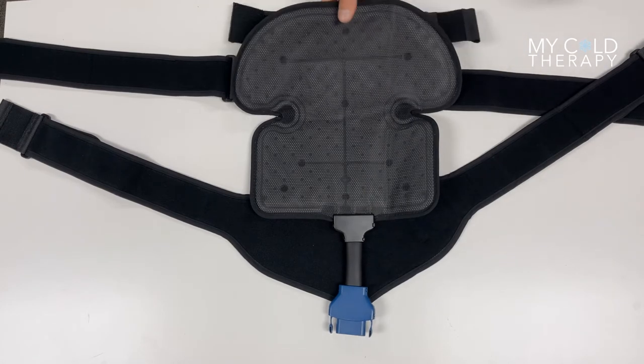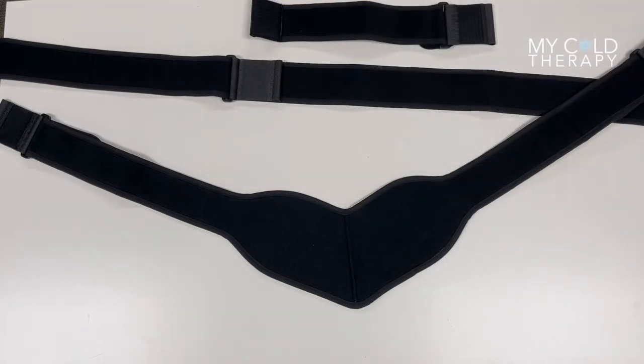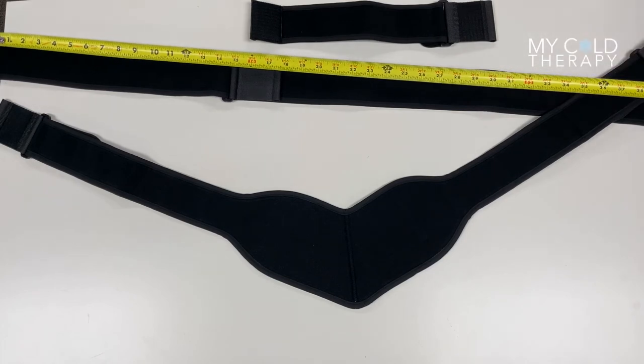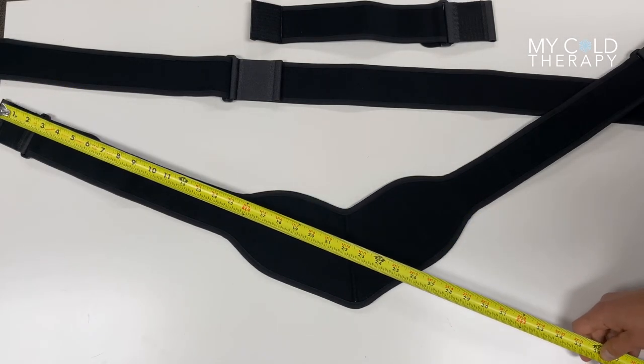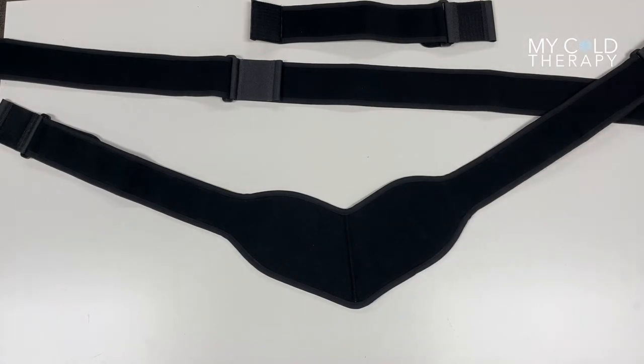This pad comes with three different sets of straps. The universal pad can be used for your shoulder, hip, or knee. It comes with a small strap which is 13 inches long. The longer strap, which can't be seen in full on the video, is 45 inches long. And the third strap is 21 inches long to the middle and 21 inches long out, so the strap is a total of 42 inches.